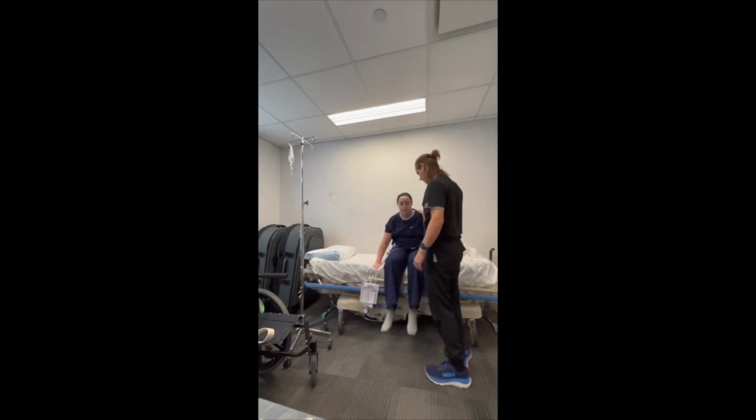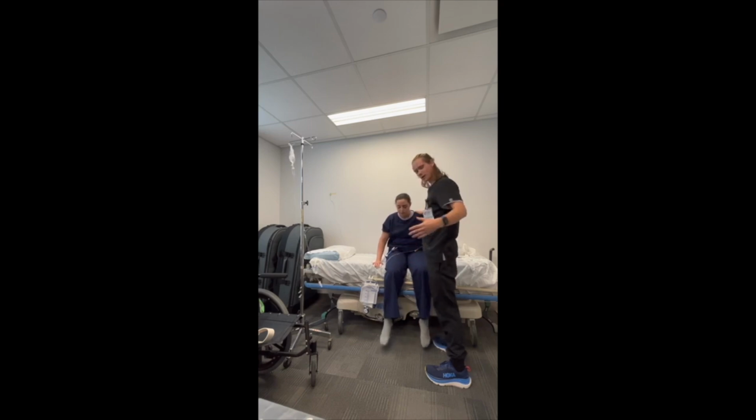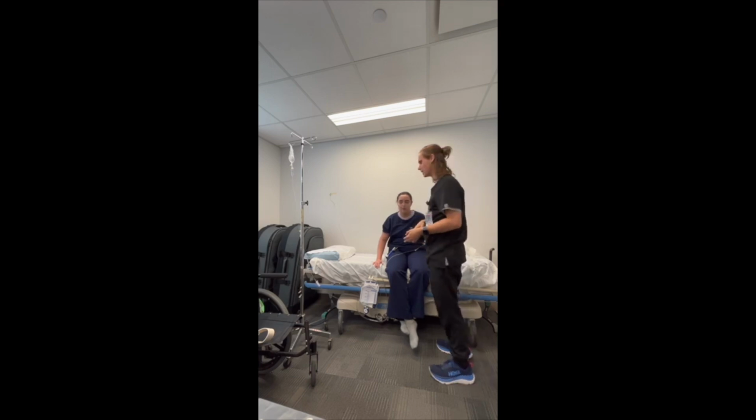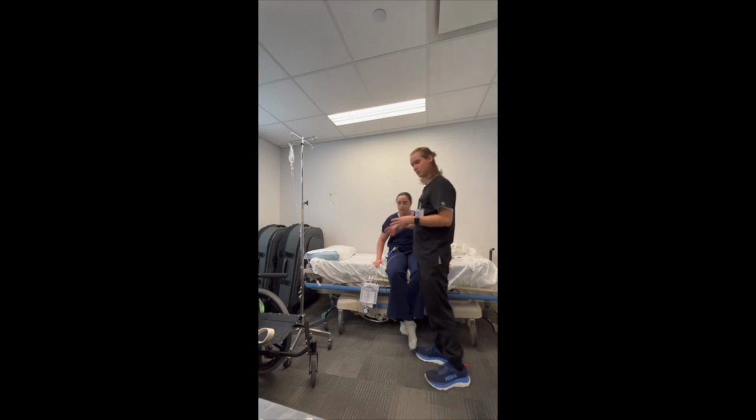Great job. Okay. So now that we've done a little bit of mobility, we want to reset and recheck all of our lines and tubes to make sure that everything is where it should be, and that in our next mobility, which is going to be a stand pivot transfer to this wheelchair right here, we want to make sure that we run through our checklist again and that nothing is going to be a problem.